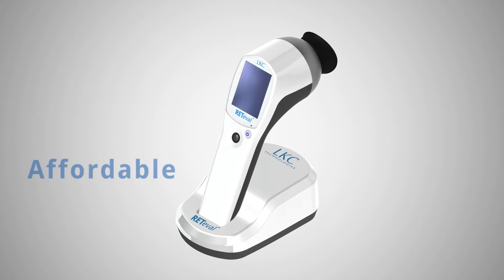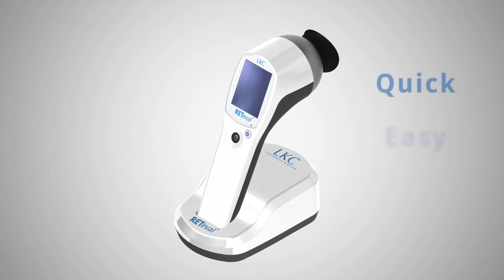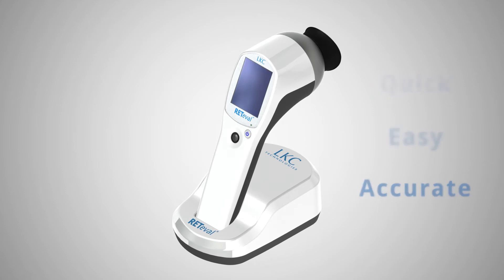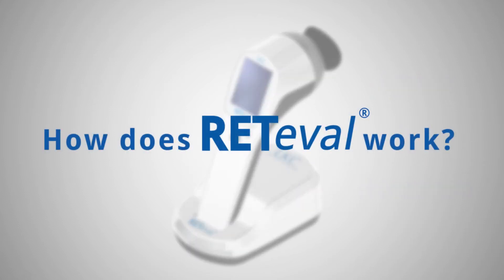This affordable handheld device provides quick, easy, and accurate assessments of the presence of sight-threatening diabetic retinopathy. So, how does RETeval work? Here is a brief demonstration.